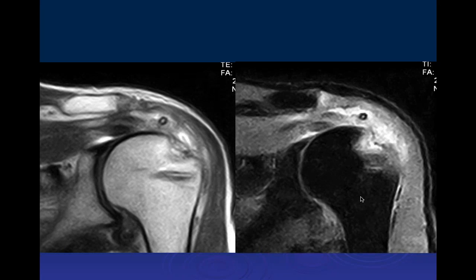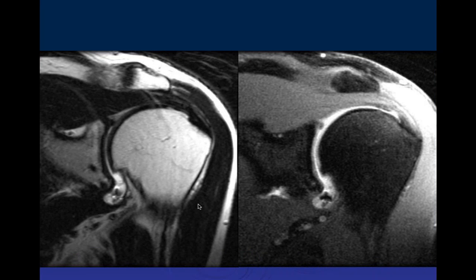There appear to be two anchors. The lower one is in an unusual location — it's way below the footprint. This may have been a double-row technique with one anchor at the footprint and another out where the sutures grabbed the tendon for the second row. However, the lateral anchor still needs to be at the lateral margin of the footprint — you cannot place sutures below the greater tuberosity. This one tore, obviously, because it was placed incorrectly.